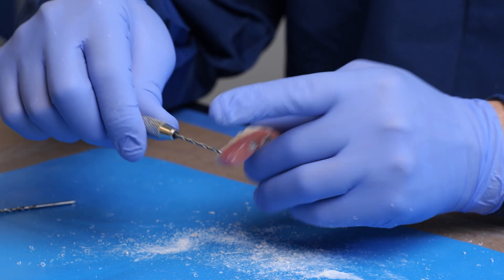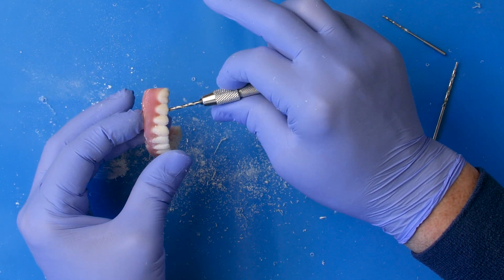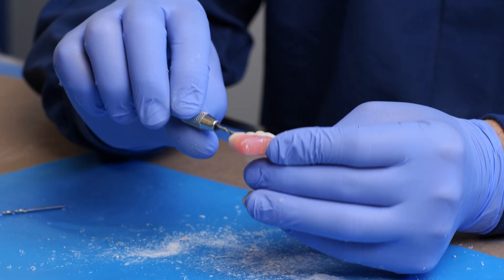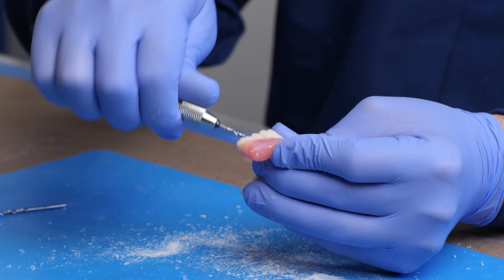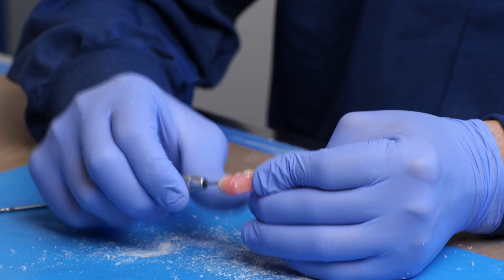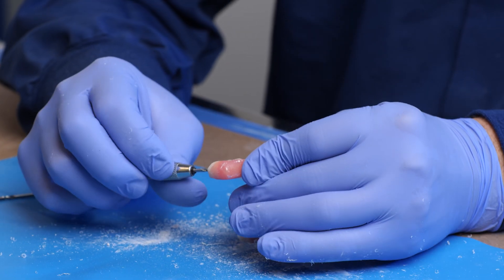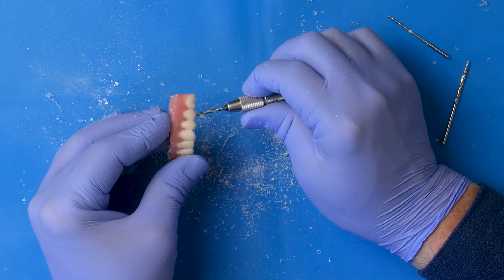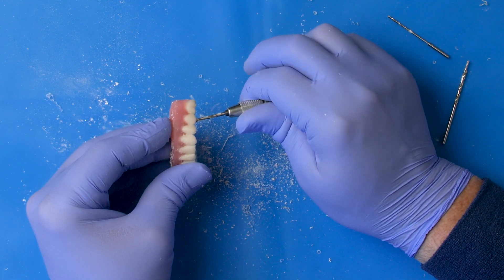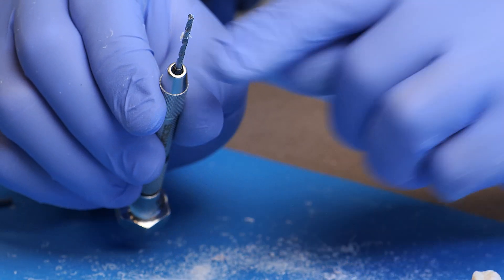The drill is only cutting in a clockwise motion, so we just turn it clockwise — going back and forth does you no good. Turn it clockwise five times with light pressure on the tie base. Then wobble your wrist and create a little bit of slop while turning five times clockwise. Then push really hard and turn five times clockwise. Then lighten your pressure and turn five times clockwise. Finally, keep turning about five times while withdrawing the drill bit from the screw channel.